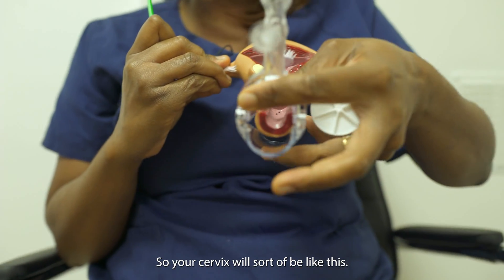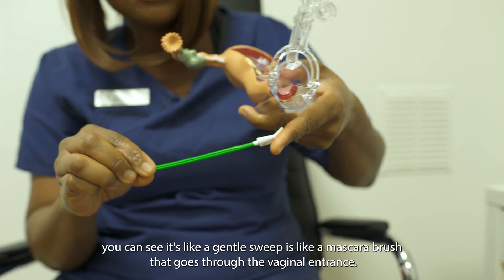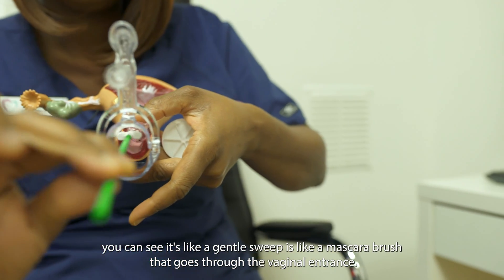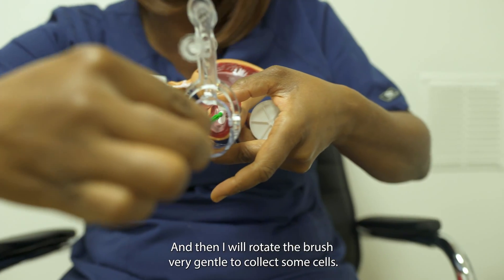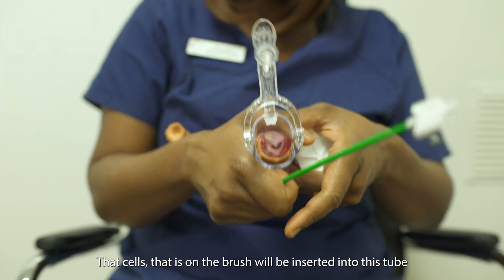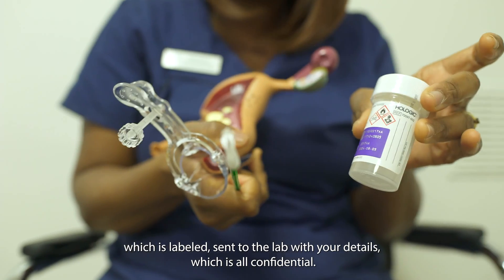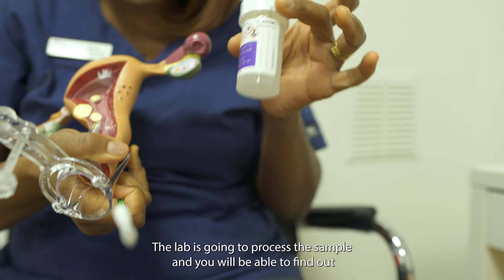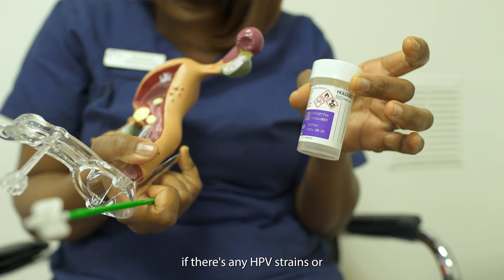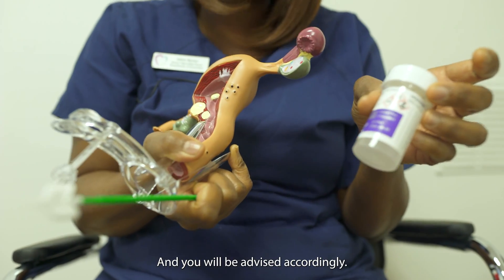So your cervix will sort of be like this. The brush, which is very gentle — you can see it's like a gentle sweep, like a mascara brush — goes through the vaginal entrance. I will then rotate the brush very gently to collect some cells. Those cells on the brush will be inserted into this tube, which is labeled and sent to the lab with your details, all confidential. The lab will process the sample and you will be able to find out if there are any HPV strains or any abnormal changes, and you will be advised accordingly.